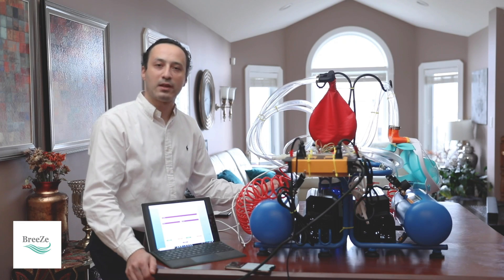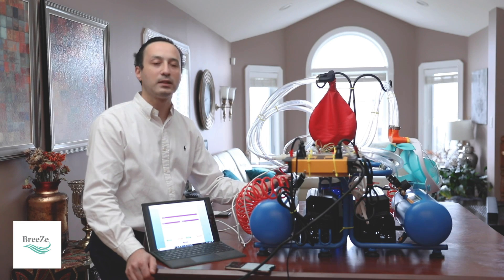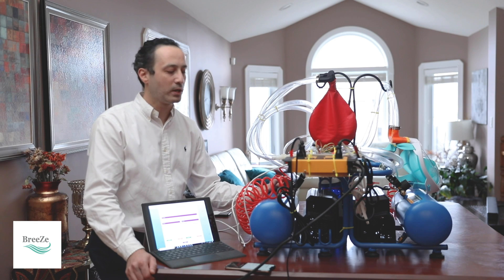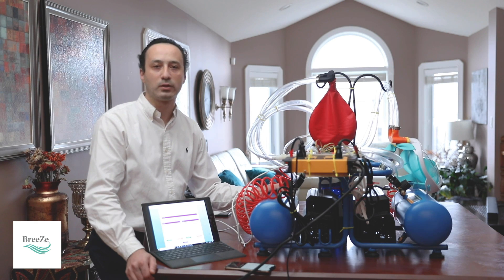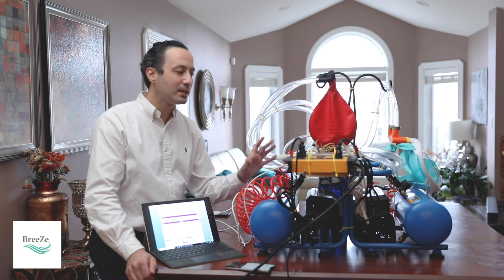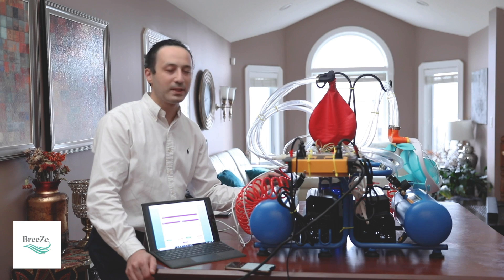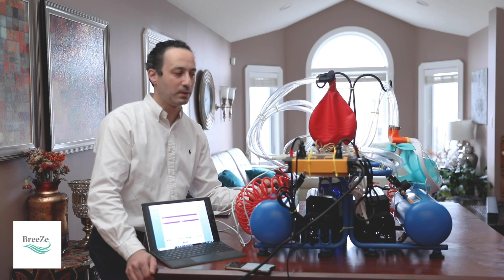We named our ventilator Breeze Ventilator, or Breeze Modular Ventilator. This ventilator has two main advantages. The first advantage is it is built entirely from readily available parts that you can find in a local hardware store. Assembling this ventilator can take about a day for any regular person with basic knowledge on how to assemble it.